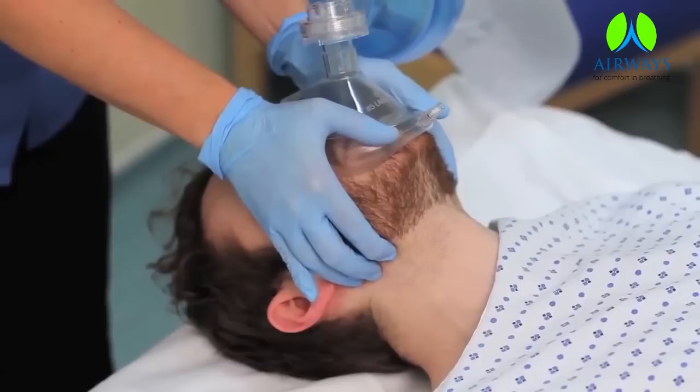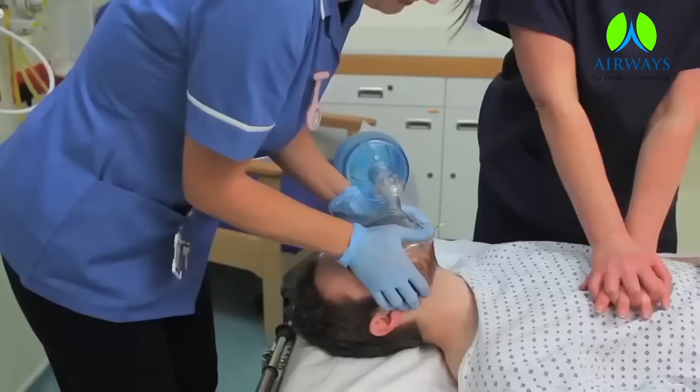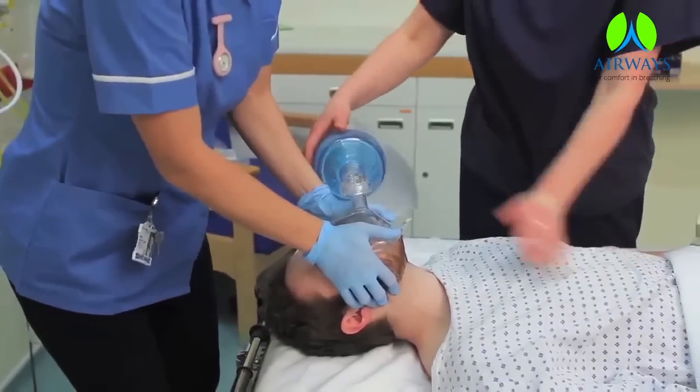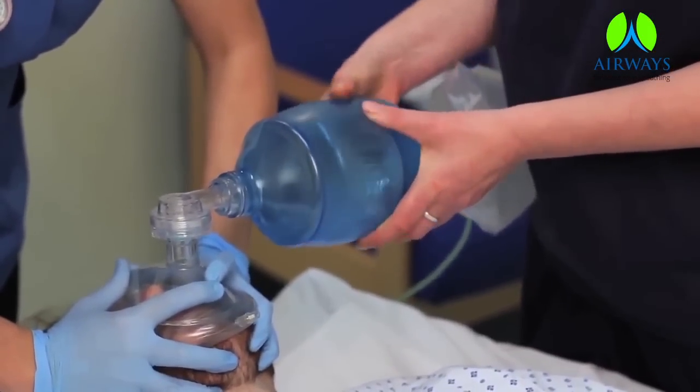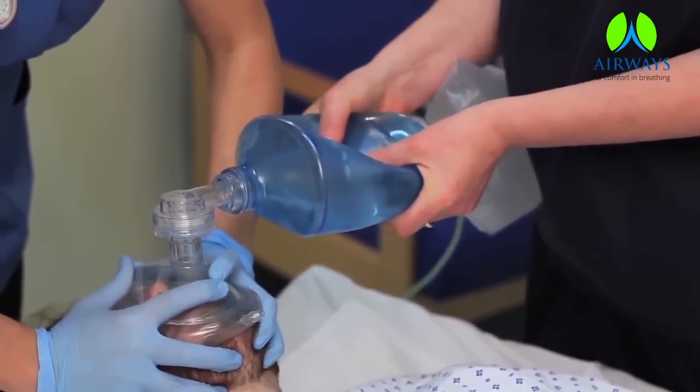Hold the mask to the patient's face with forefinger technique. Be sure to open the airway. Gently squeeze the bag with enough force that the patient's chest rises.